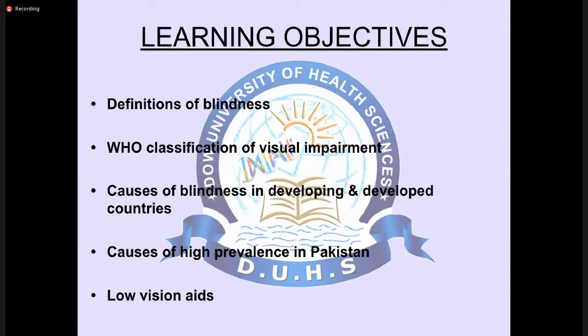Place the patient at the designated distance, usually 20 feet or 6 meters, from a well illuminated Snellen chart. If glasses are normally worn for distance vision, the patient should wear them. By convention, the right eye is tested and recorded first. Completely occlude the left eye using an opaque occluder or the palm of your hand, alternatively having the patient cover the eye. Ask the patient to read the smallest line in which he or she can distinguish more than one half of the letters.